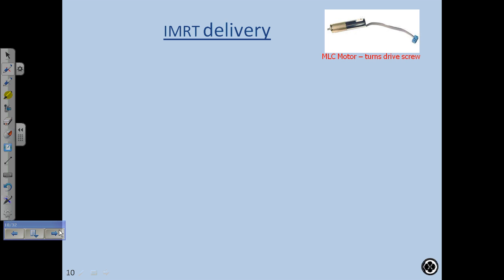When you were making the immobilization tools, do you send in a contour of the immobilization tool? No, you send in the CT scan. Right. So you'll make the immobilization tool, put the body part in it, and scan it. You send the whole scan. So they can see the immobilization device, but they don't really use the information of the immobilization device to build their compensator. They use the anatomy, the external surface.